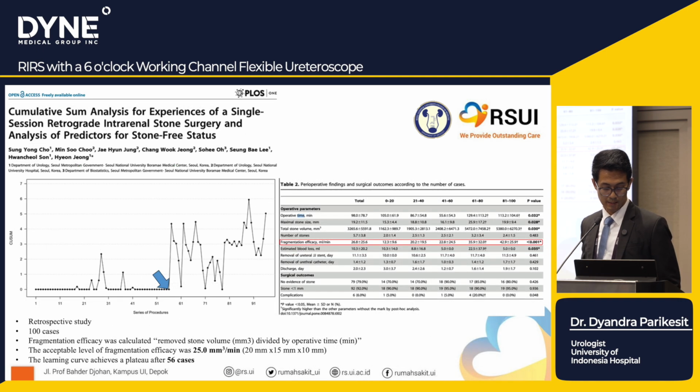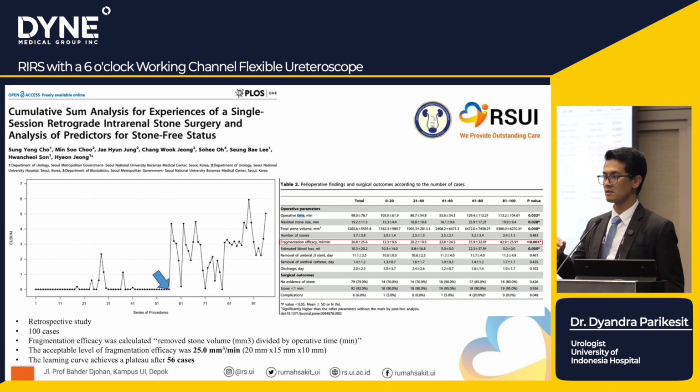This is also Professor Cho's research, looking at fragmentation efficacy with flexible RIRS, and we found that the plateau begins after 56 cases, so it's more or less the same. You need additional time and cases to handle the flexibles better.